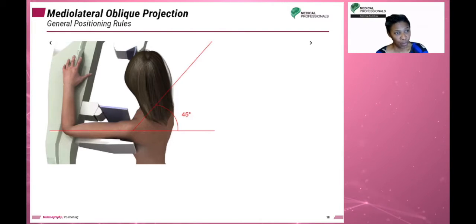Was there something removed? Versus, did you have a biopsy? Did you simply have an aspiration? Some patients just call any form of surgery a lumpectomy, but make sure that you are defining it properly for the radiologist. If the patient said they had a lumpectomy, it should be that they had a cancerous lump removed from their breast.